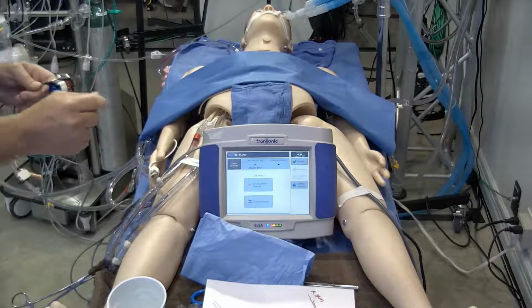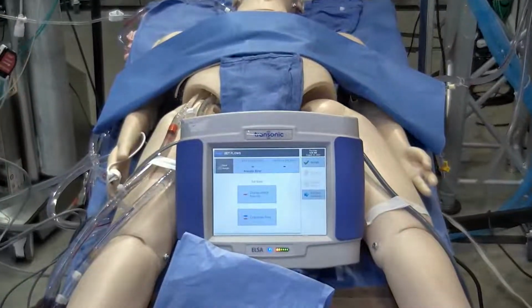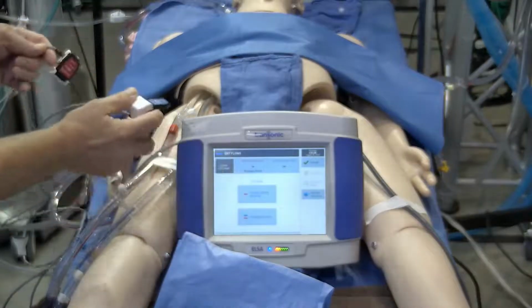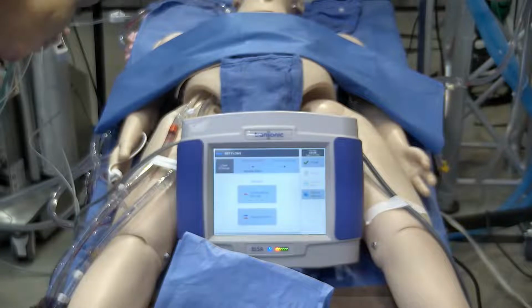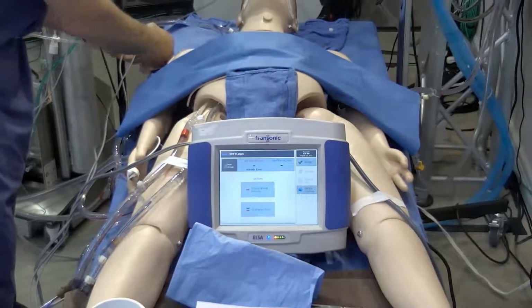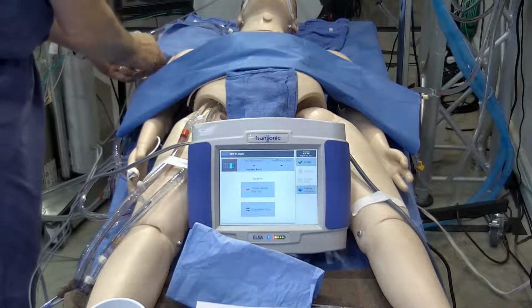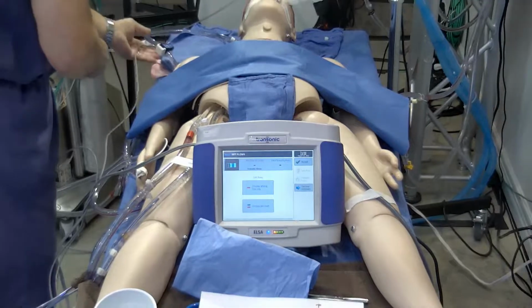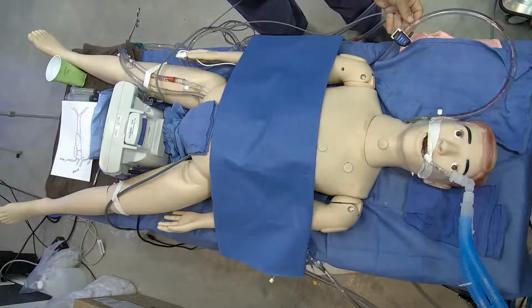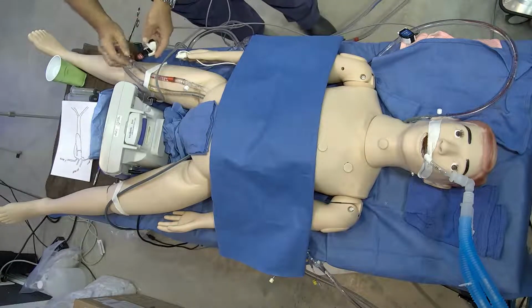In this particular case, what we're going to use it for is for measuring flows. So I'm going to put the blue probe, which is normally venous, on the line going to the head, making sure the arrow is in the correct direction. And can we show that on the overhead? Yeah, there you go, right here. Okay, and I'm going to put the red flow probe on the femoral artery.